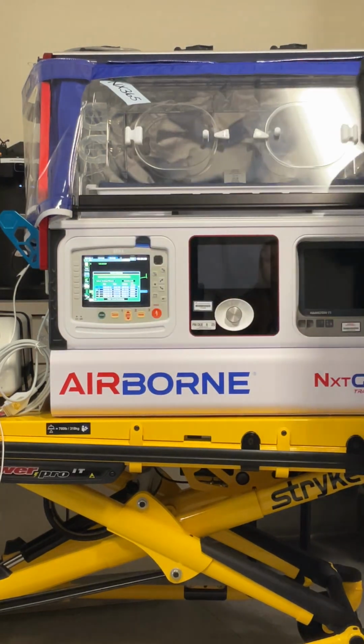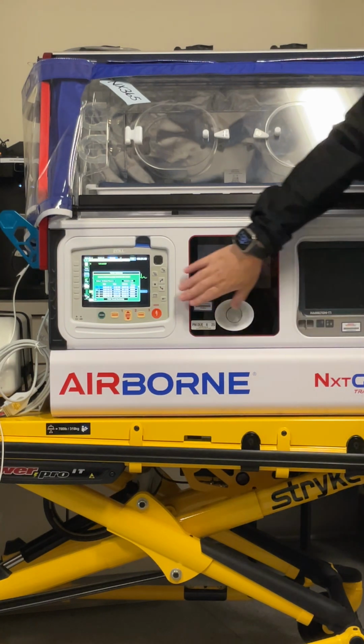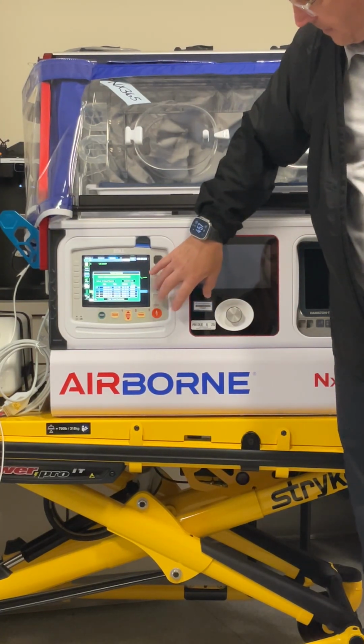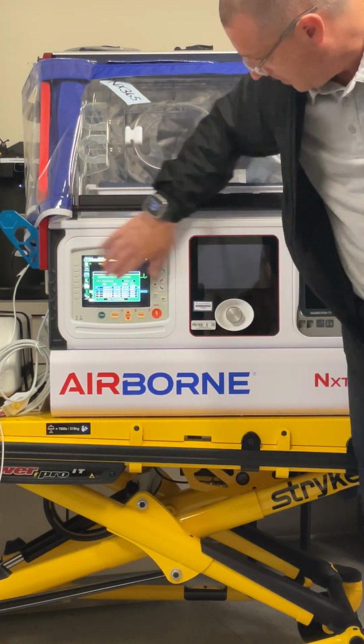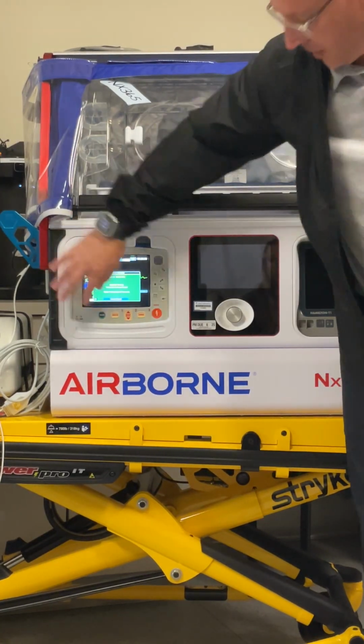The top one, the clipboard. So if you select the clipboard, home, clipboard. The top one is the case we are currently working, unless we had the monitor off for 2 minutes, and then it would be the second one down. So we select the one we want, and then you can print that one off.